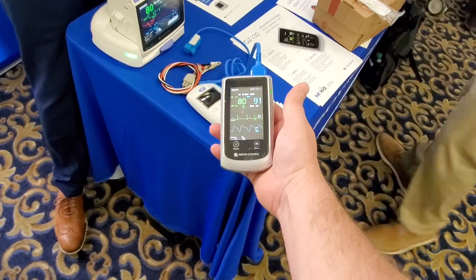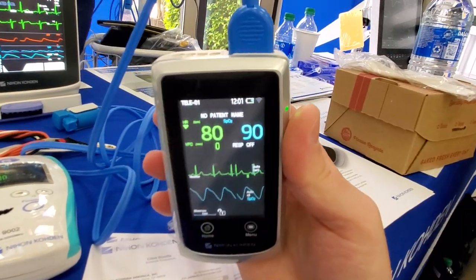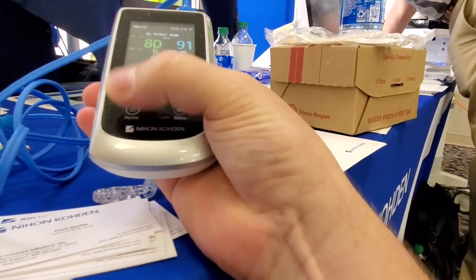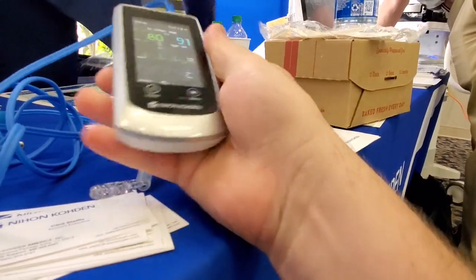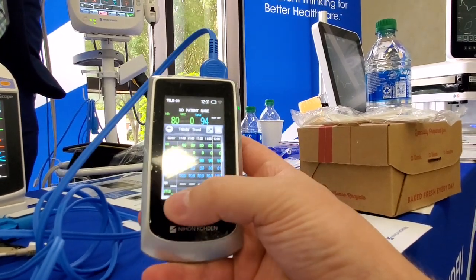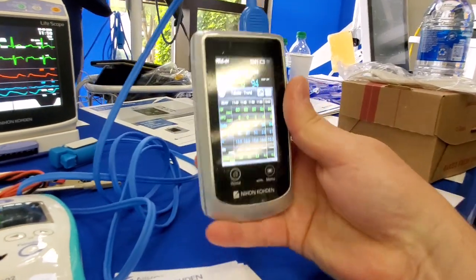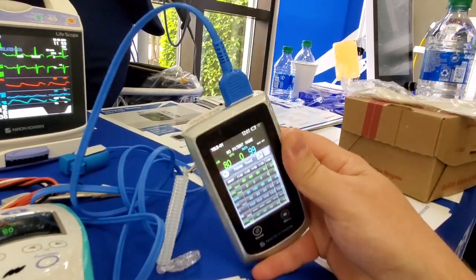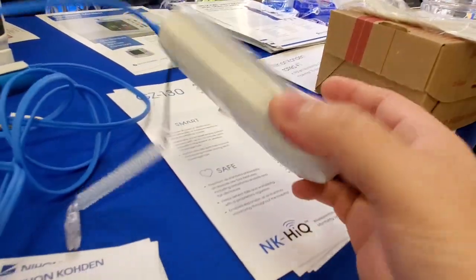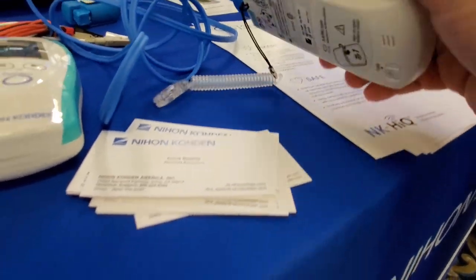This right here is the GZ-130 telemetry module. It's powered by two AA batteries. And look at that screen — it is a beautiful screen. It's a touchscreen, works really well. High resolution color display, powered by two double A's. We've got 12-lead EKG and we've got SPO2. That's the GZ-130 — really lightweight unit, looks super durable, and they say it's waterproof. I dig it.